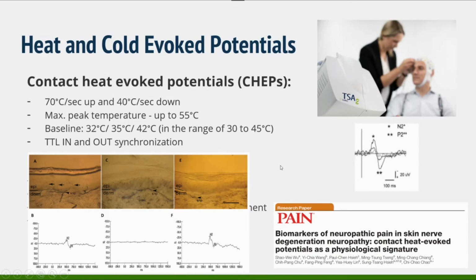So the authors think that it can be related either to the sensitization of peripheral afferents or to the neuroplasticity of the central system, because there is maybe some chronification of pain. So it not only gives you information about the functionality of small fibers, but also gives you some hint about the mechanisms of neuropathic pain in this case. So it's very interesting results. And those of you who are interested in this field, I recommend to look at this paper.